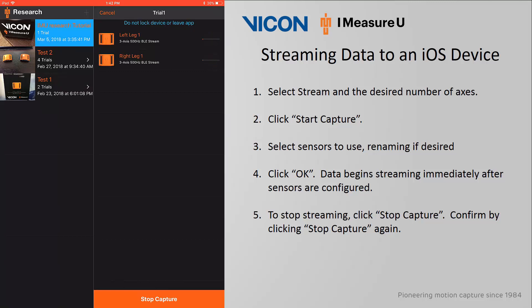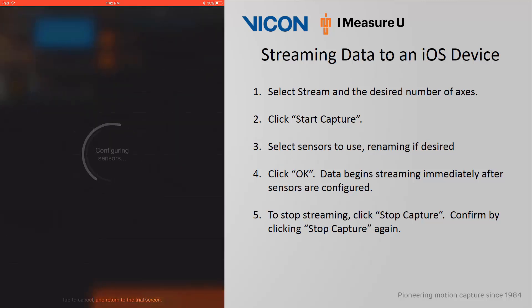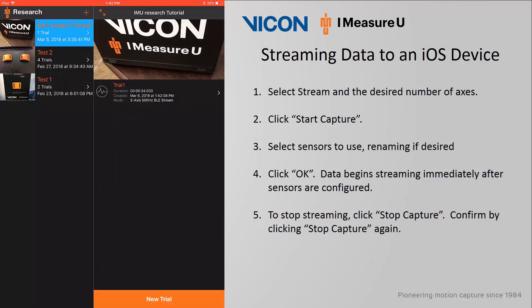When you wish to stop the stream, click Stop Capture. The app will prompt you to confirm this request, so click Stop Capture once again. The sensors will again reconfigure and then you will be brought back to the home screen.